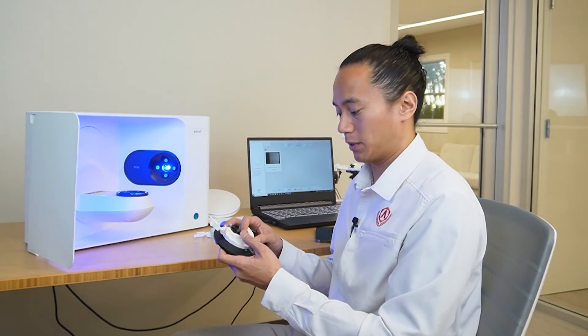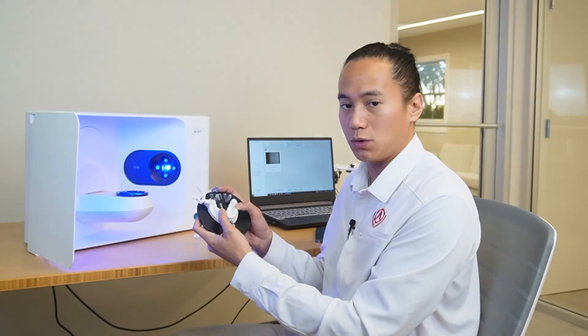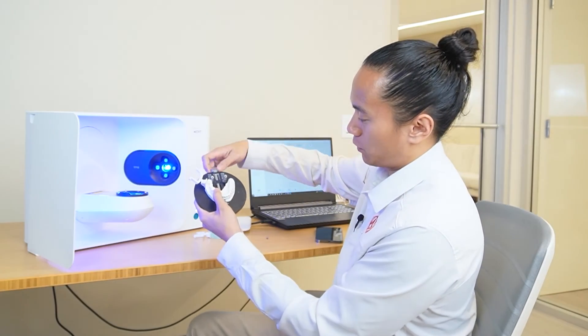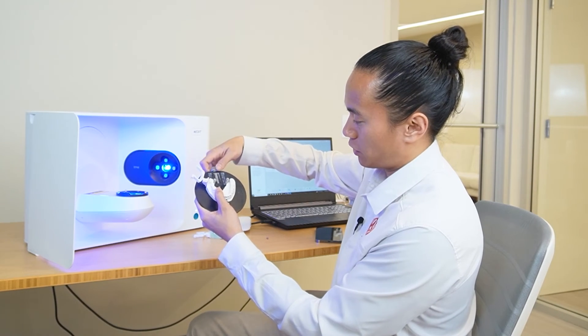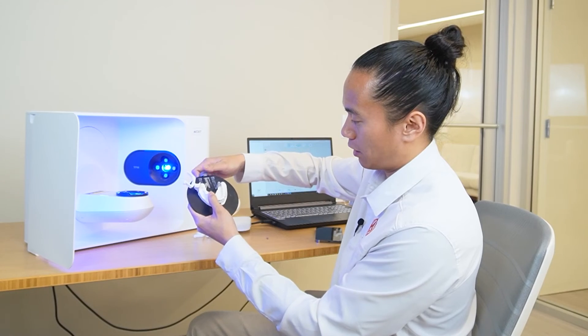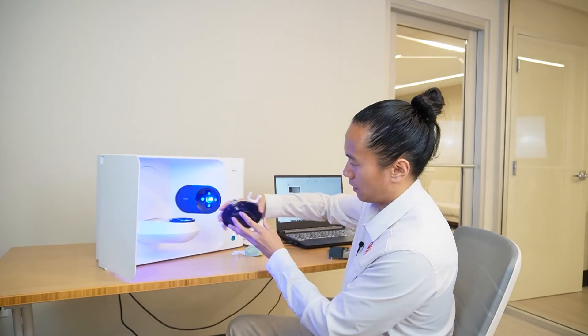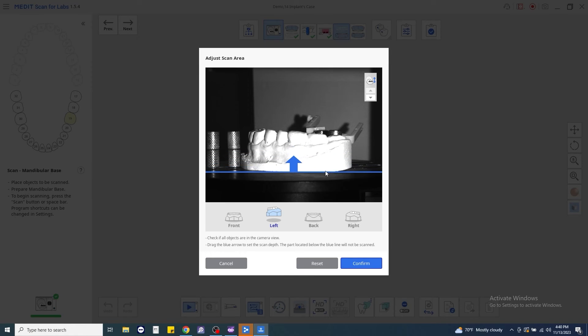The last step in scanning our implant case will be scanning our opposing scan. Again, we're still going to be using the full arch clamping stage here and we're just going to tighten it and make sure that we apply even pressure all the way across our model. It's not going to move during the scanning process. Place that gently into our scanner, confirm our brightness, and start our scan. Again, confirm the model height.